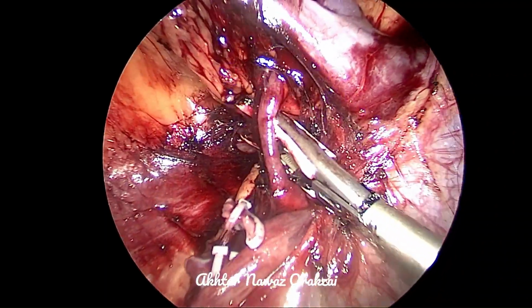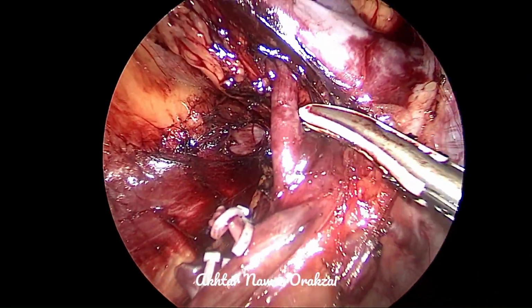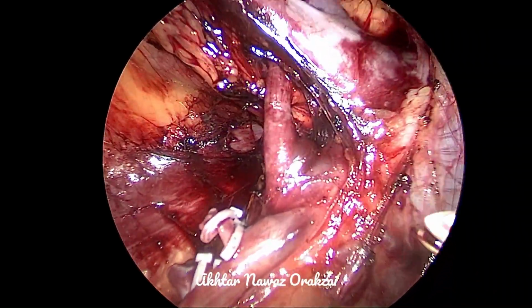So we made a window. You can see a very thinned out base of this vein connecting to the IVC.